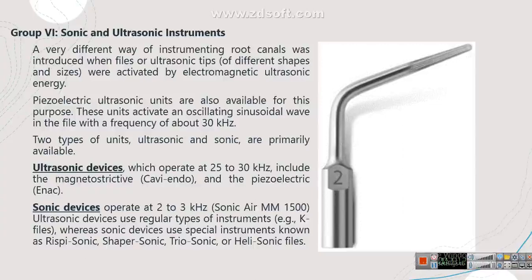So, sonic and ultrasonic instruments. It is quite important for dentists to use sonic and ultrasonic instruments because there are many advantages, like the activation of the irrigation solution within the canal system, especially if we want to clean the apical third.